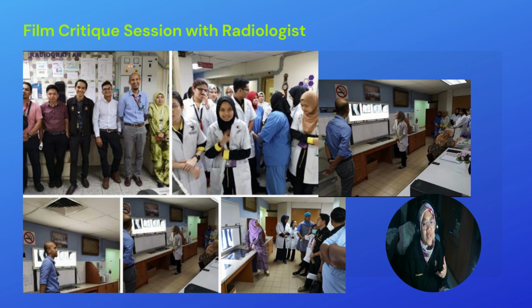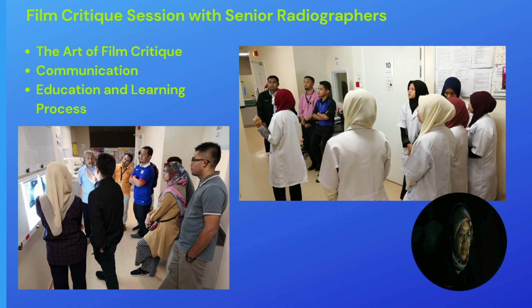And the radiologist will guide and teach radiographers to improve the quality of radiographs. There is also a film critic session with senior radiographers in the evening, so we can also teach students and new radiographers, and improve the services, how to perform proper positioning of the patients, to reduce rejects and retakes of radiography.